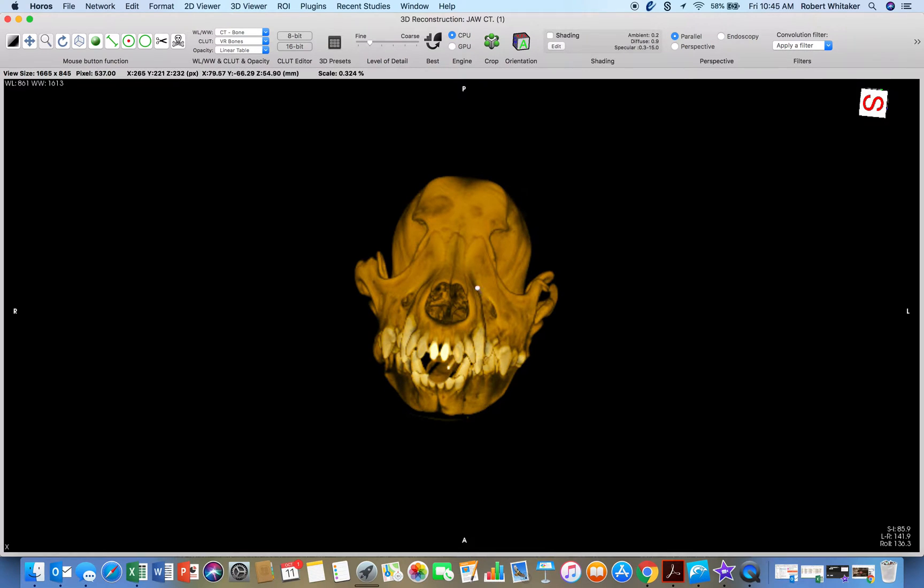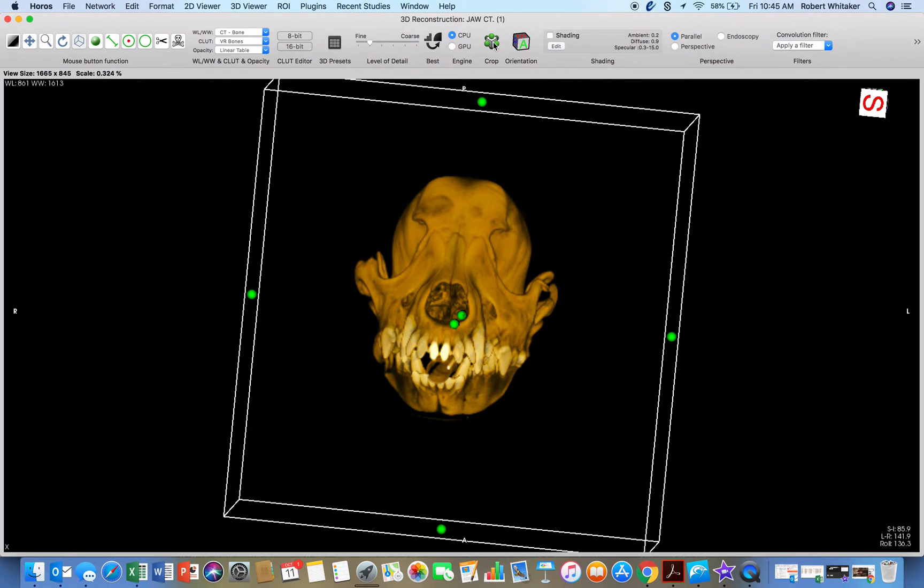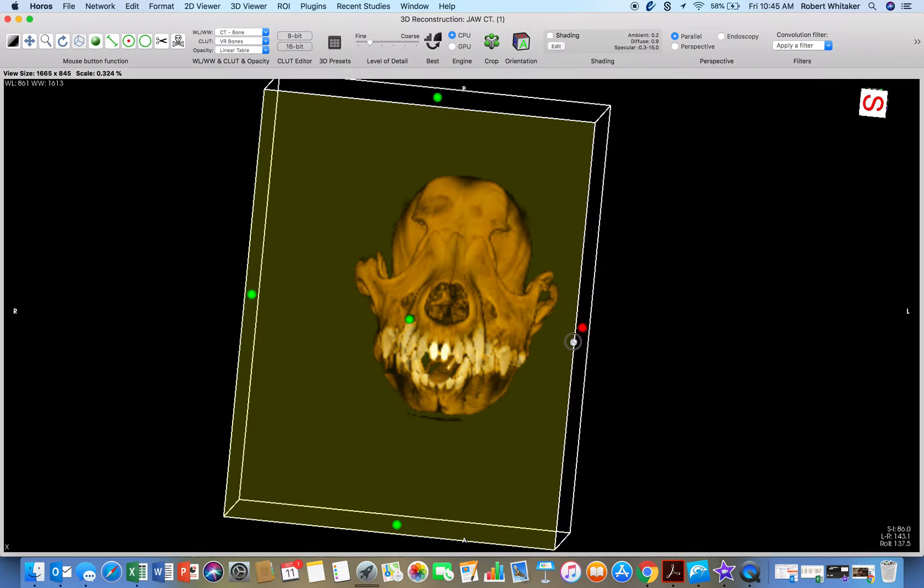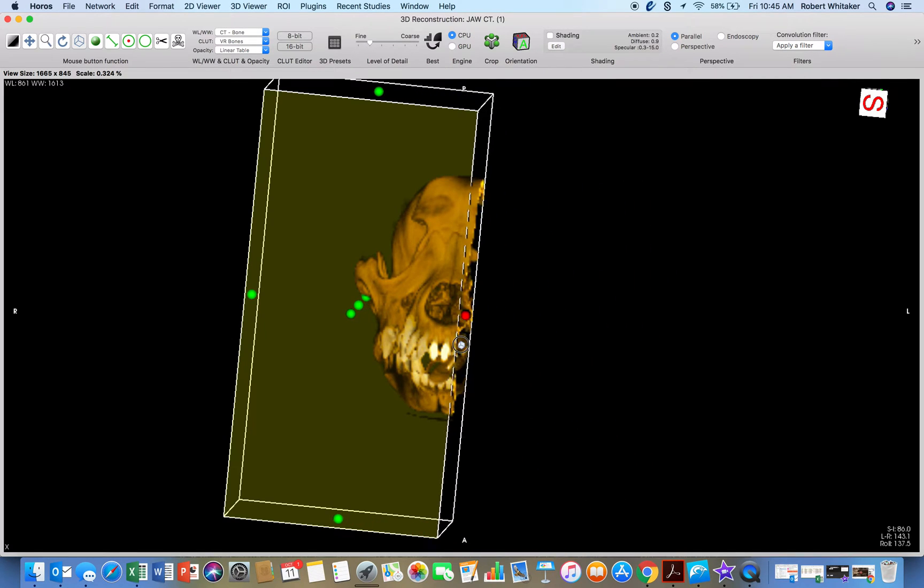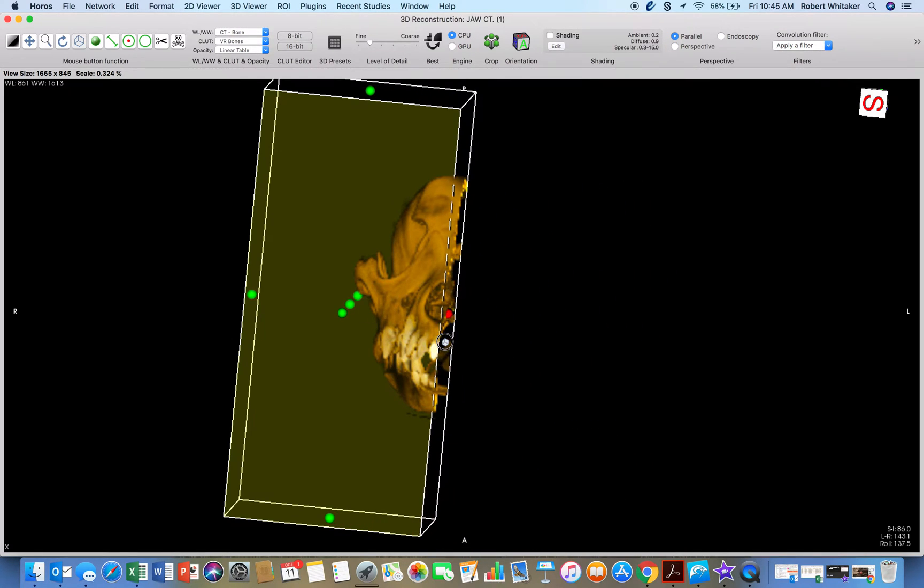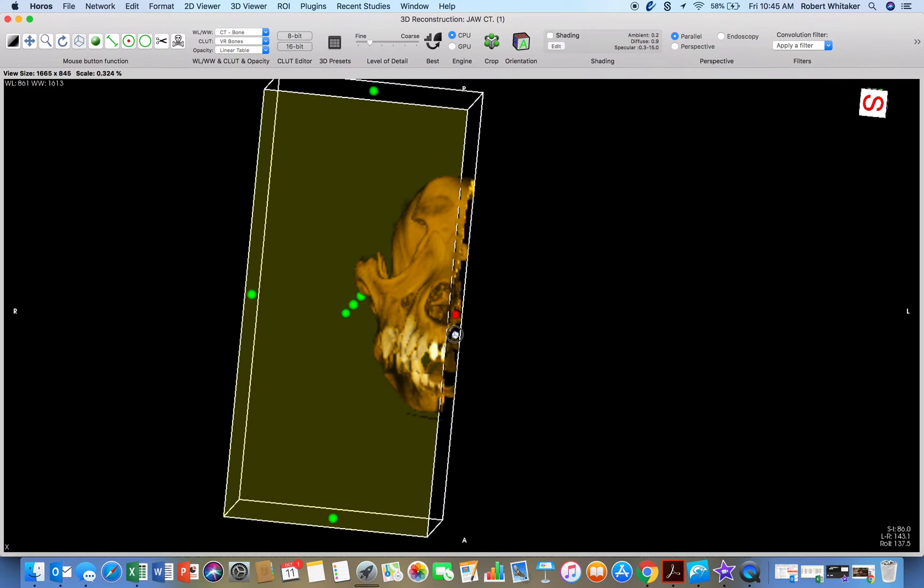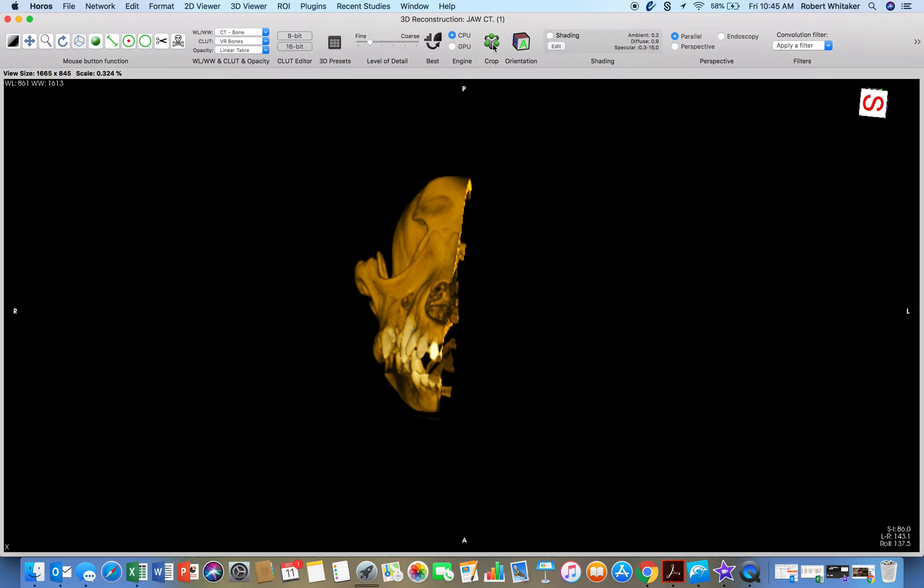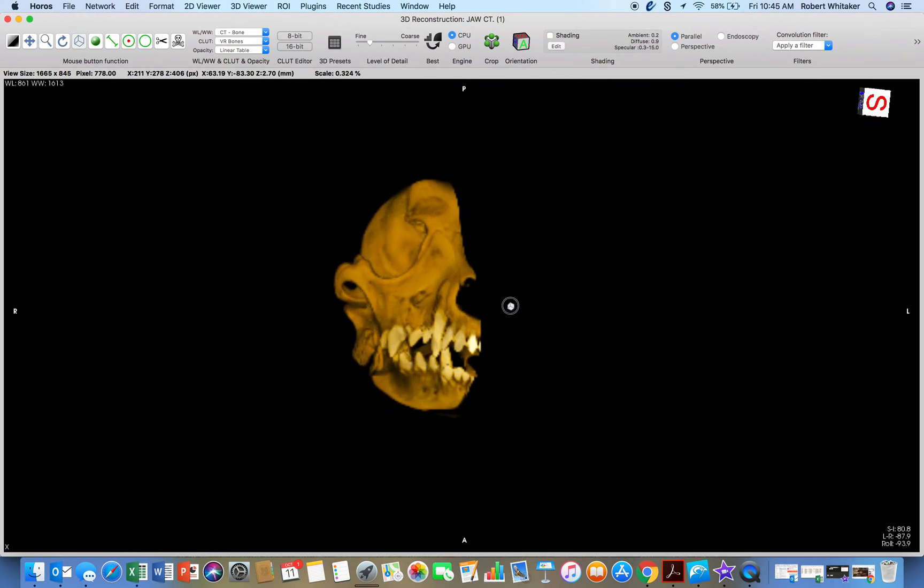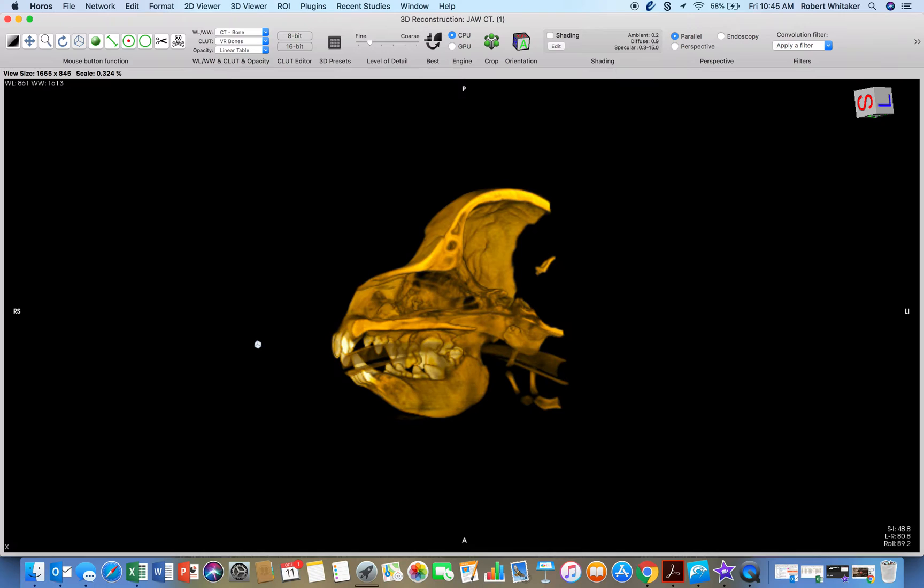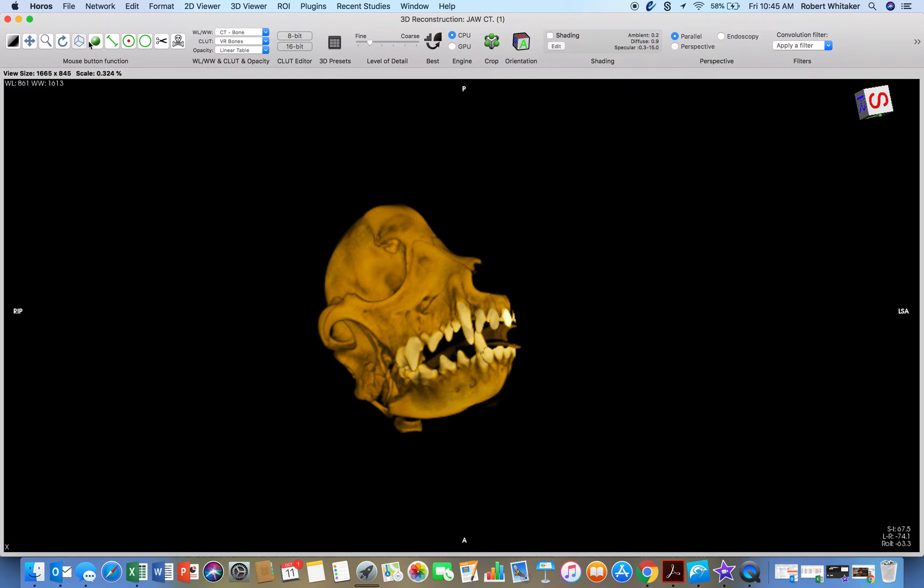Now I want to crop half of the skull. And go into the cube with the green spheres. Each green sphere is one side or the top or the bottom. Half of the skull goes away here. Give them left click, holding left click, and moving. Let go. Press this one more time to make it go away. Now we can turn it and see different directions.